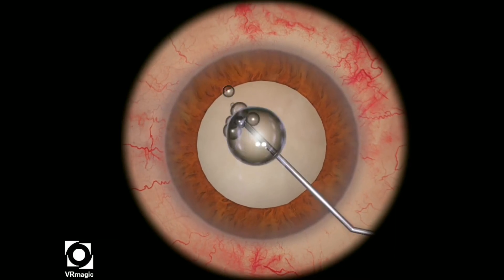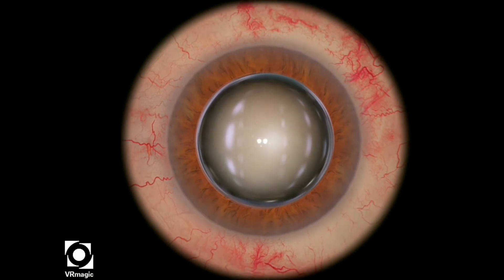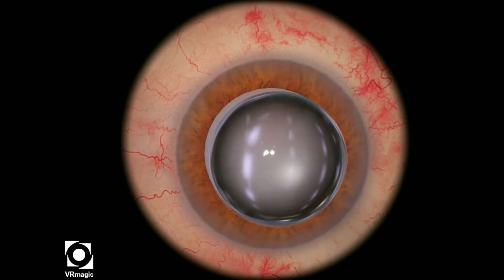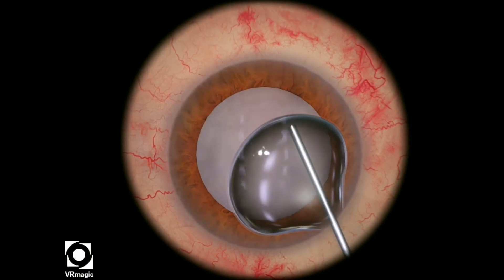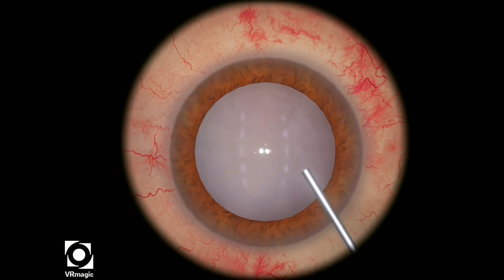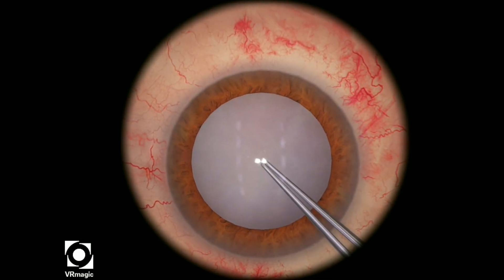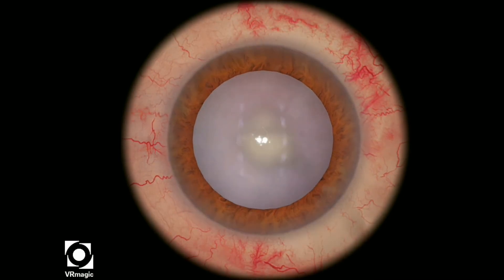Let's take a look at that one more time. We'll start off with an air bubble, fill the AC with the TriPan Blue to stain the anterior capsule, use the BSS cannula and wash out the TriPan Blue, fill the eye with viscoelastic. Here we go again — small little poke. Do not propagate the rhexis in the usual fashion, just a smaller poke in the center.